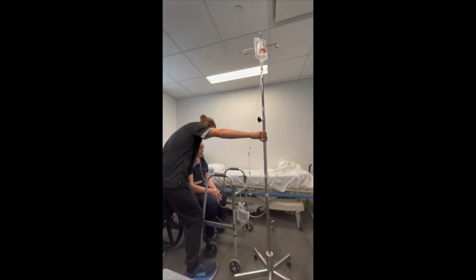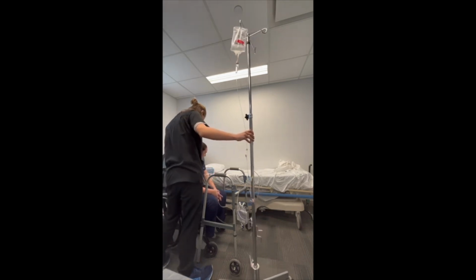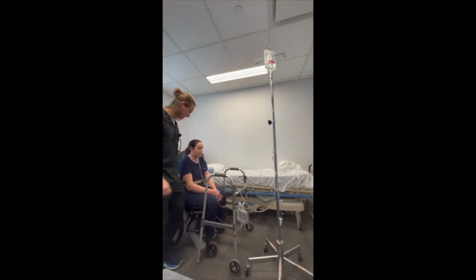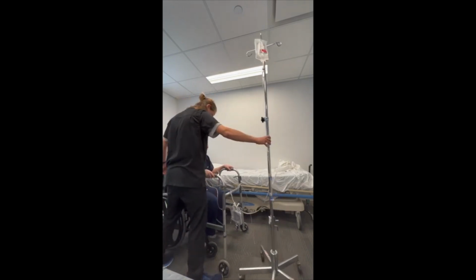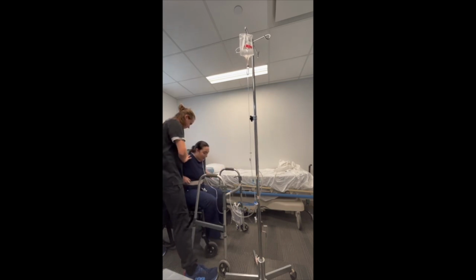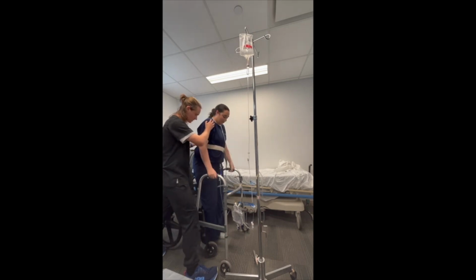So I'm going to get into position. Where should I push off of? So what we're going to do here is you're going to stand up by pushing off of the armrest. Okay. And then once you're standing, I want you to come up and grab onto the walker a little bit, okay? All right, so remember we're going to push off from the armrest. Right. And let's rock forward. On the count of 3, we're going to stand. 1, 2, and 3. All right, and then you can grab onto the walker.